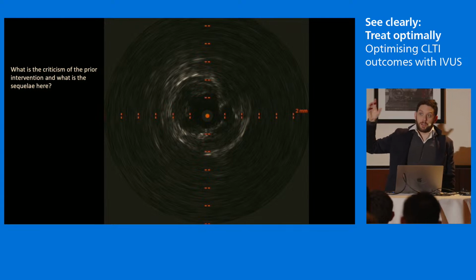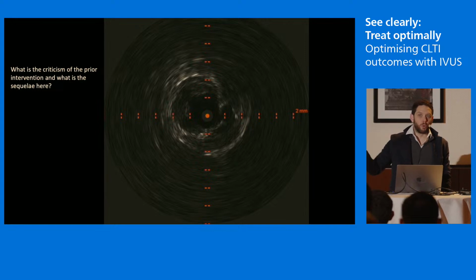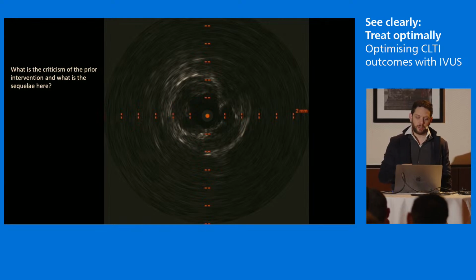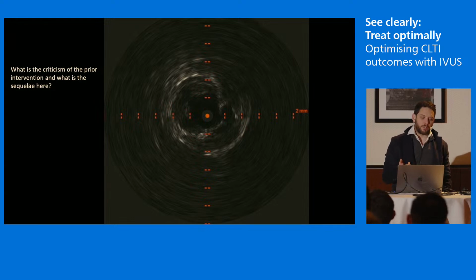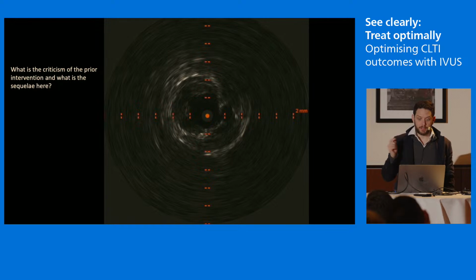So I think the learning point there is an undersized stent can actually be more of a pathology than a perhaps badly positioned stent. So healthy to healthy, sure, but also get the right size. The reason we used IVUS here is because we weren't really convinced why on angio there was a problem at all. She had good flow, but actually it was just undersized, and there was thrombus forming, almost like a dissection, flapping over the distal end of her stent.